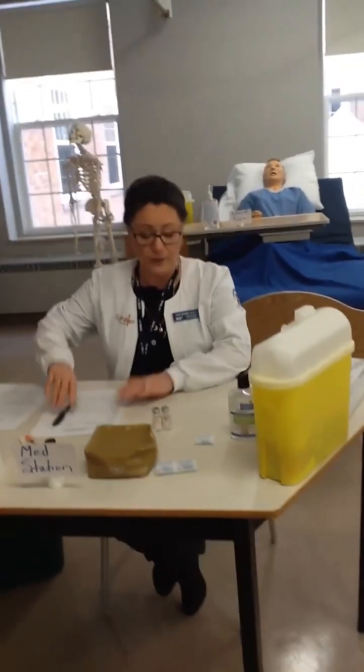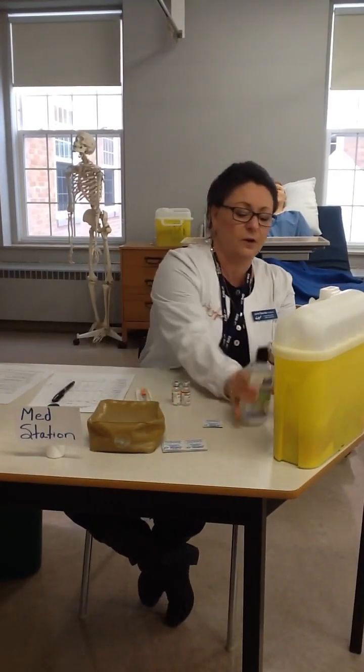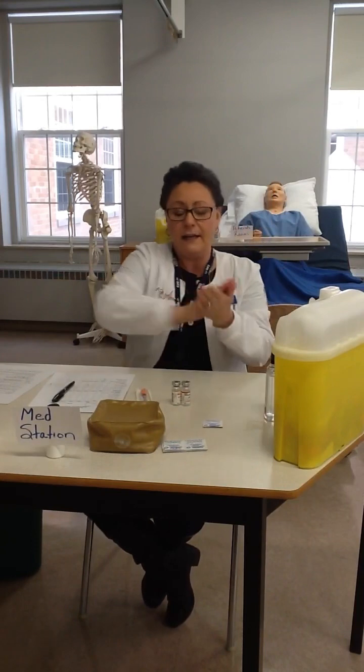Back in my med room, I have gathered my supplies. I have insulin R and I have insulin N. I've checked the expiries on those both to make sure they're okay. I'm doing some hand hygiene before I touch my equipment, and I've also made sure I have a clean surface to prepare these medications on. So now let's talk about our 3 checks and our 10 rights. We have 2 medications. Those 3 checks apply to each medication independently as we go through our steps.